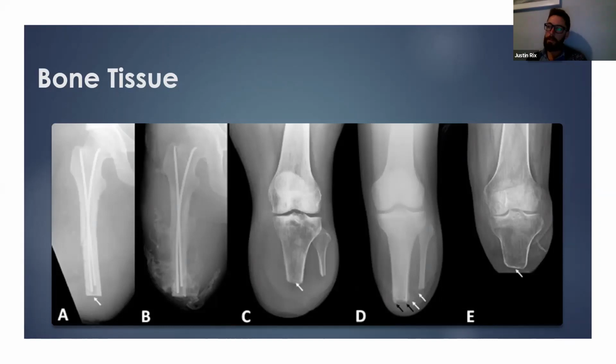Although we can relieve this with a bit of socket relief, it shouldn't really be necessary, and it should be a standard consideration, in our opinion, during surgery. Again, we understand if it's emergency surgery, going back to it at a later stage to revise it would be a better option for the patient.